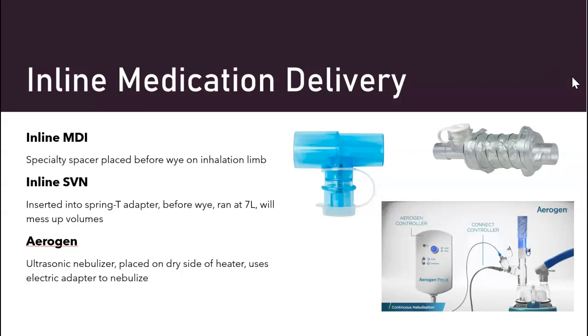It's lovely. Also, these little white caps, there are multiple layers of them that you can open and close that allow for different sized MDIs. You can take the MDI out of the boot, and different medications sometimes have different ports, and this has different shapes for the different medication ports, so you can flip and have the different sizes for the different ones.